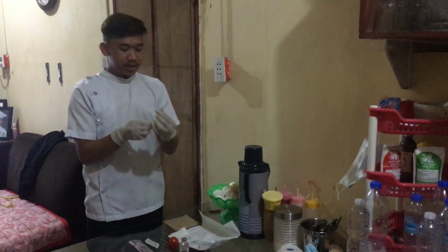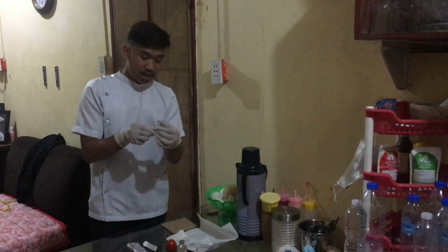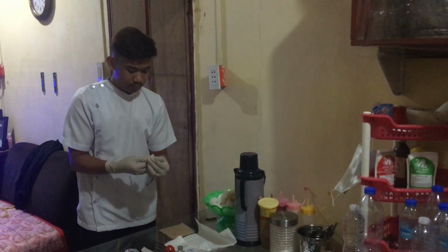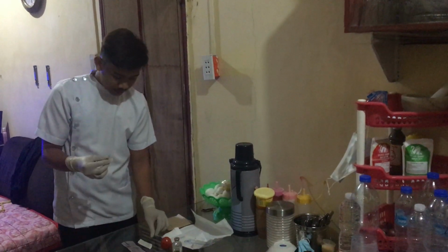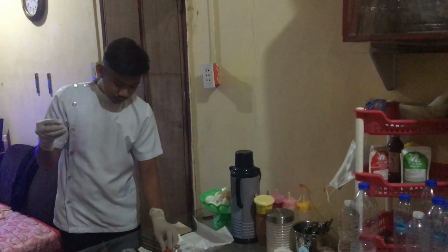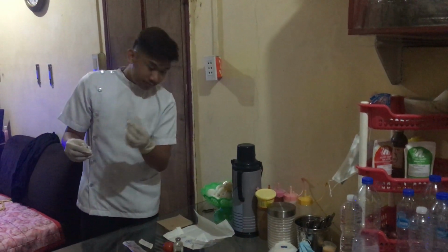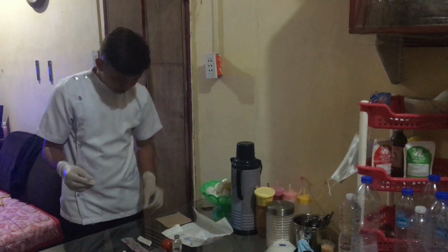I'm going to cap it, and then remove the aspirating needle, and then discard the aspirating needle and put it in the sharps container.